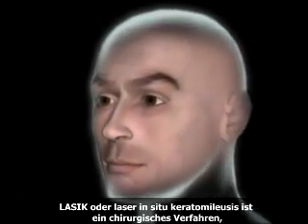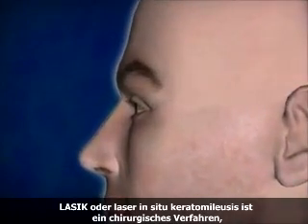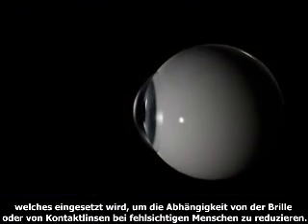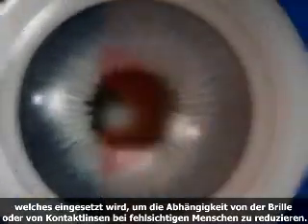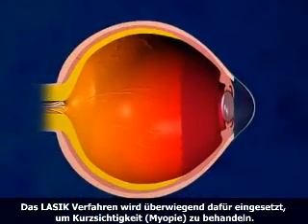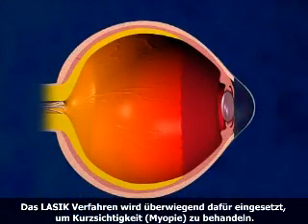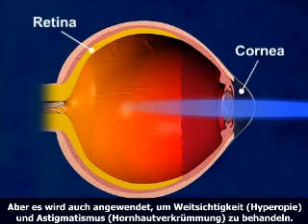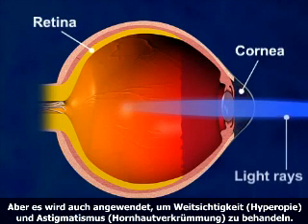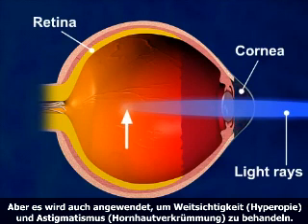LASIK, or laser-assisted in-situ keratomileusis, is a surgical procedure intended to reduce a person's dependency on glasses or contact lenses. LASIK surgery is most commonly performed as a cure for myopia, or nearsightedness, but can also be used to cure hyperopia, farsightedness, or astigmatism, which are corneal irregularities.